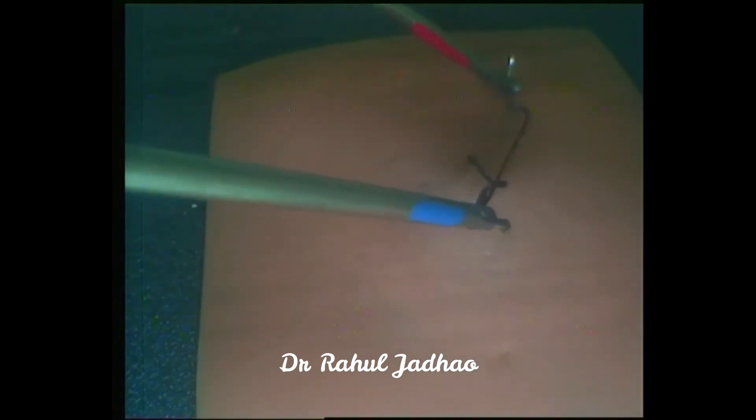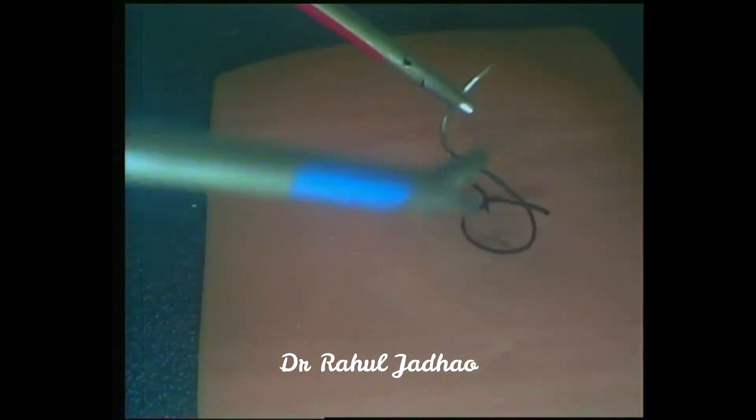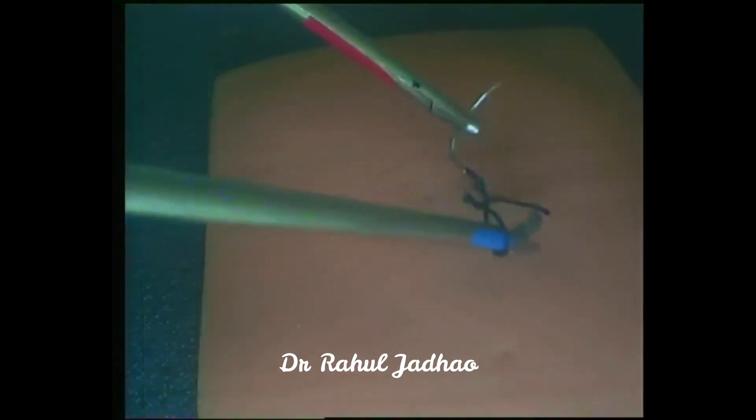This is the overlap around the swage end of the needle. Again, the needle is positioned in the smiley position. Now this is the under wrap.